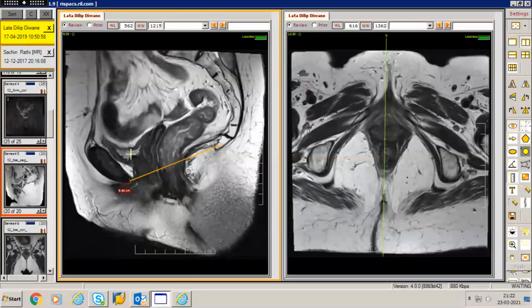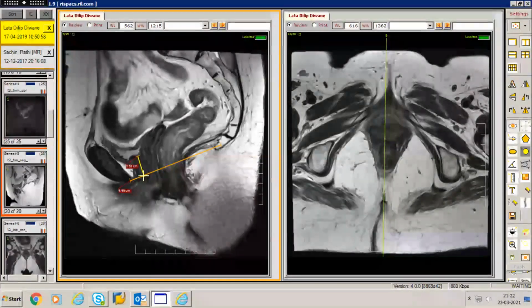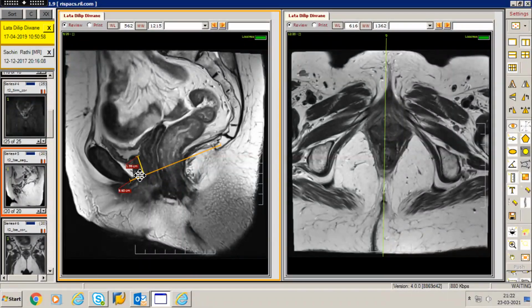For example, for the anterior compartment, we would be taking the bladder neck. So this basically is the neck of the bladder. The position of the bladder neck with respect to the pubococcygeal line is the distance you would be concerned with, to understand whether there is a descent of the bladder with respect to the line or not.